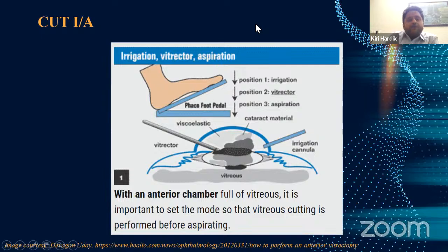And there, we all know that there are two modes available for vitrectomy: cut IA mode and IA cut mode. Sometimes people have confusion about exactly which modes we need to use for the anterior vitrectomy. So let's discuss those things first.